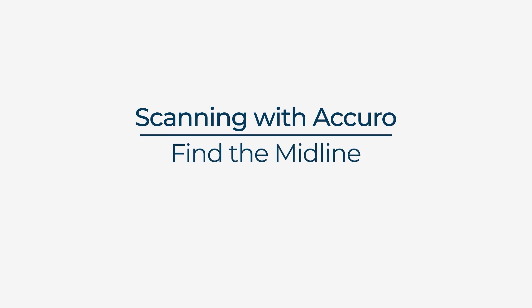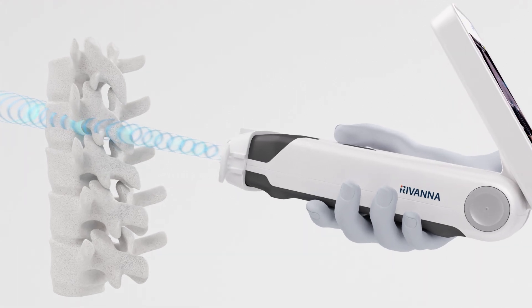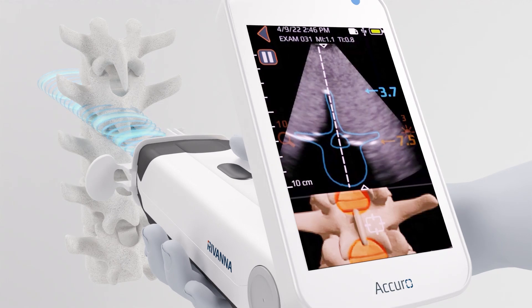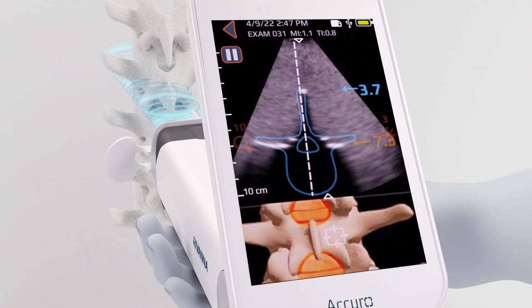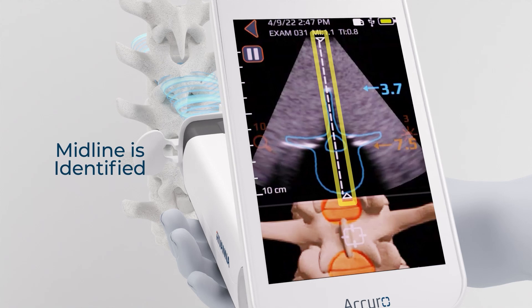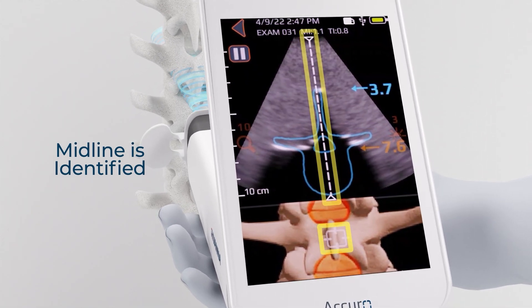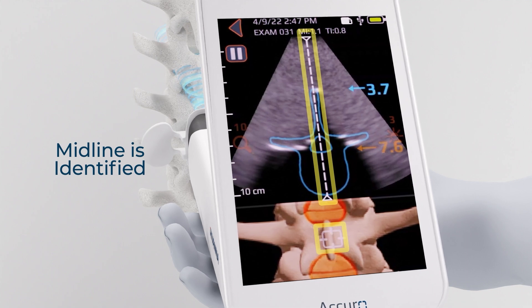Find the midline. Use your dominant hand to hold Acuro firmly against the skin. Scan slowly, horizontally, and notice the two triangles and the dotted line. Midline is indicated when the dashed line is centered between the two triangles. The 3D image at the bottom will offer additional visual confirmation as the target will be centered on the spine.